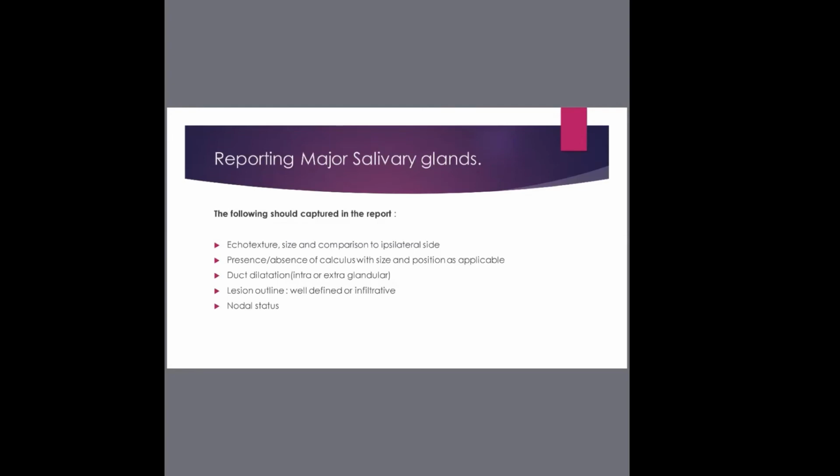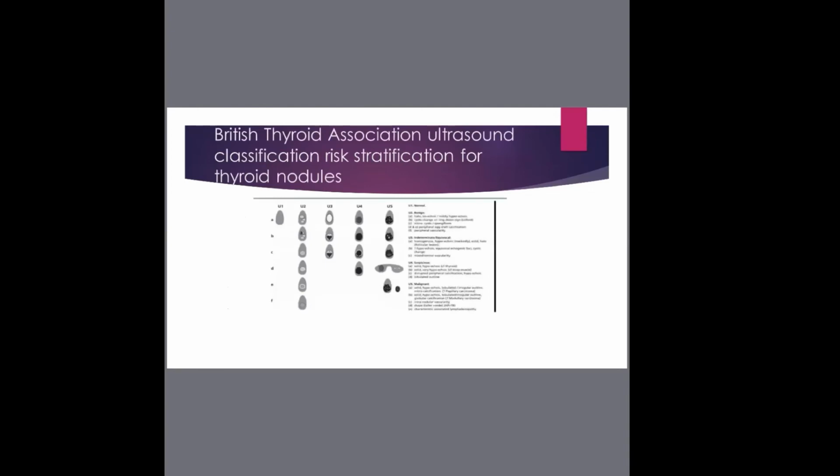Sometimes we find them incidentally. Sometimes patients don't even present with any clinical symptom. They came for other scans, but in the process of sweeping through the neck, we see them, you report. So long as it is U2 and below, it's just a follow-up. They don't have to go and take the thyroid out unless it's compressing on the neck and they can't swallow anymore, they can't breathe. In that case the ENT surgeon would decide if they have to take them out or not.